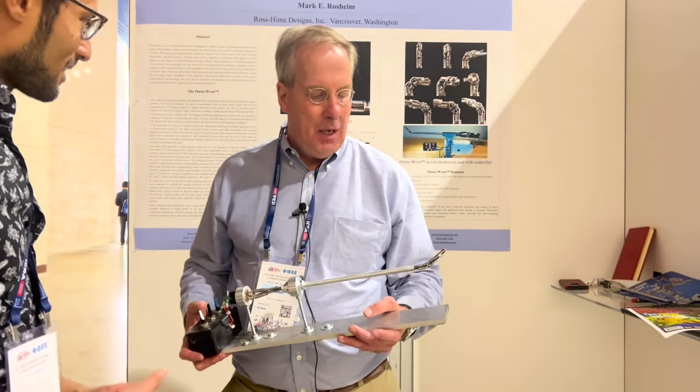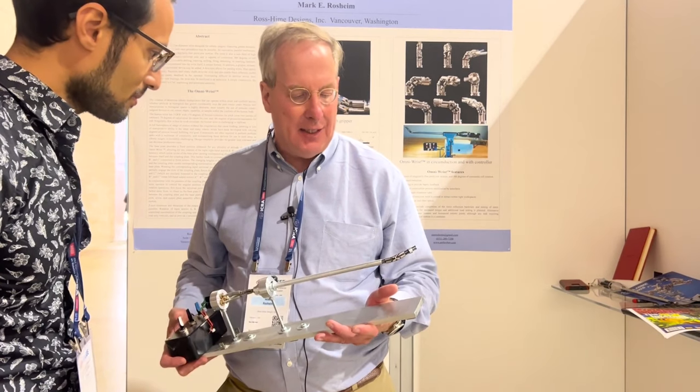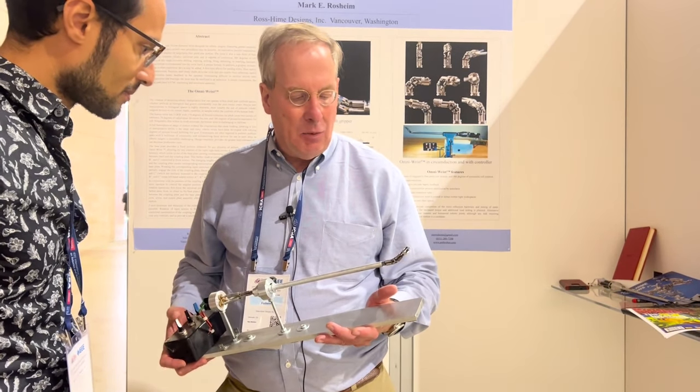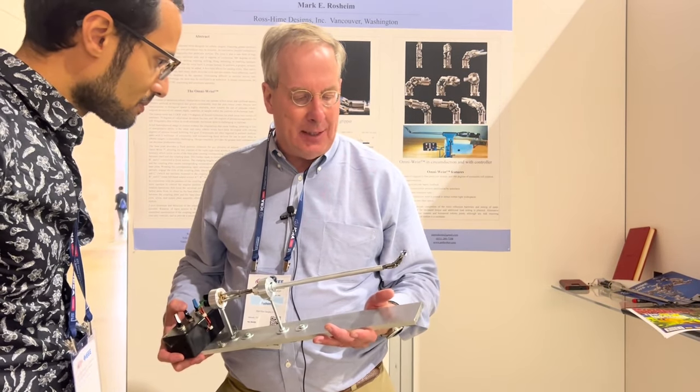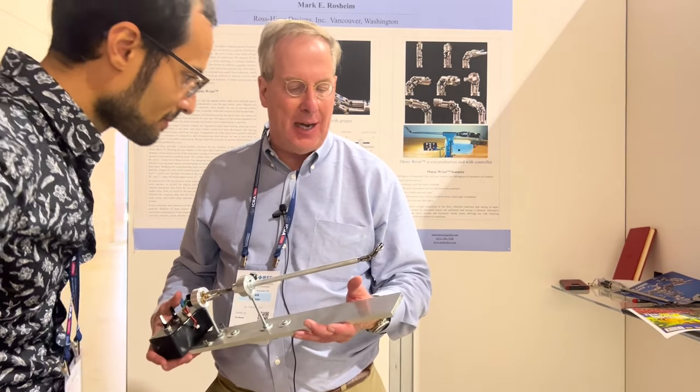So what is this platform that you built? Well, this is the Omni Wrist, and this is designed for robot surgery. We're building something a little more rugged, a little more flexible, a little more dexterous than what's been done before. And this is the very first prototype.